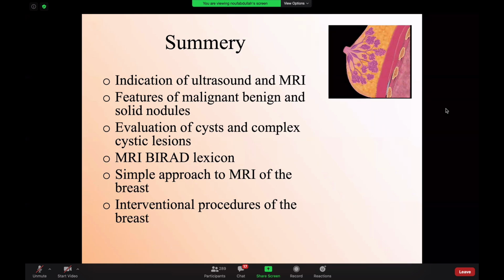Because with ultrasound, I want to identify if there is an associated mass with this microcalcification. If there is no mass associated on ultrasound, I would go back and do a biopsy for the microcalcification using stereotactic guided biopsy. So it is mainly used for microcalcification. Other indications are if you have architectural distortion and you cannot identify it by ultrasound, or you have an area of asymmetry or developing asymmetry, and also you cannot identify it with ultrasound.